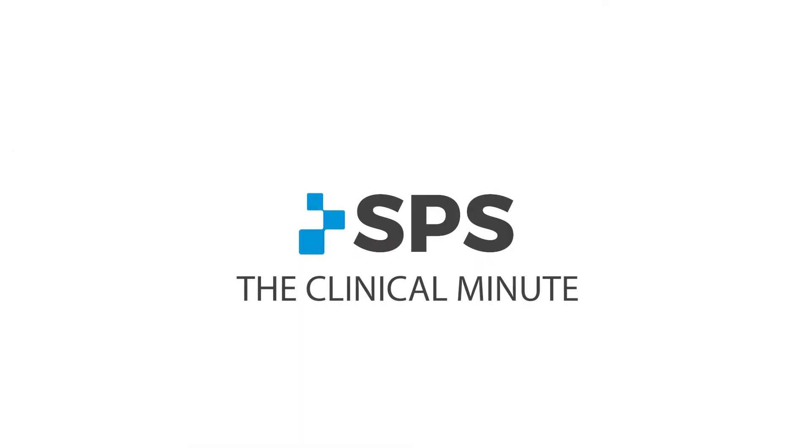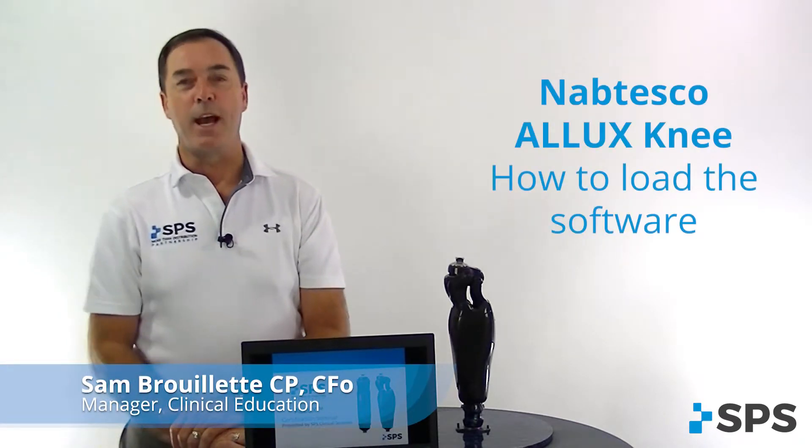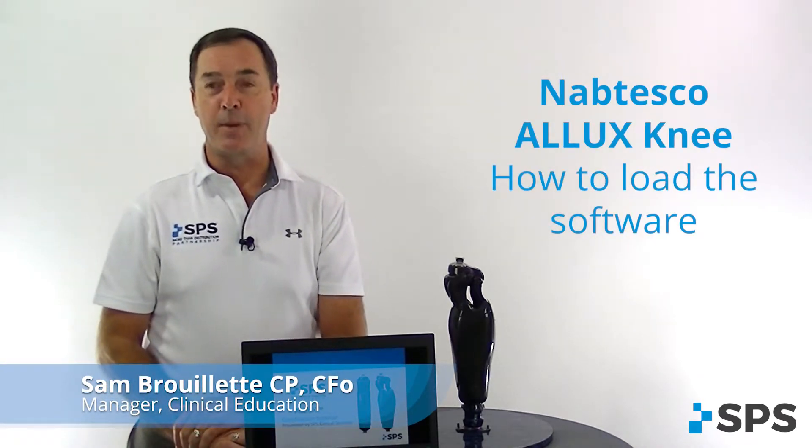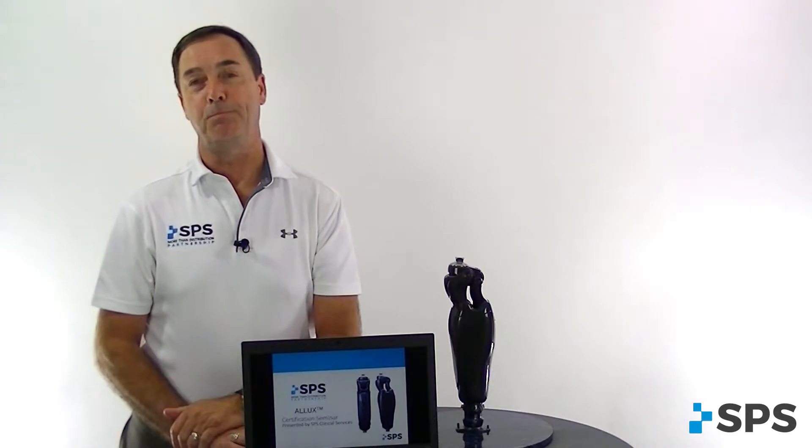Hi, I'm Sam with SPS. Welcome to the Clinical Minute. In this segment you'll learn how to load the Nabtesco ALLUX MPK software to your laptop.